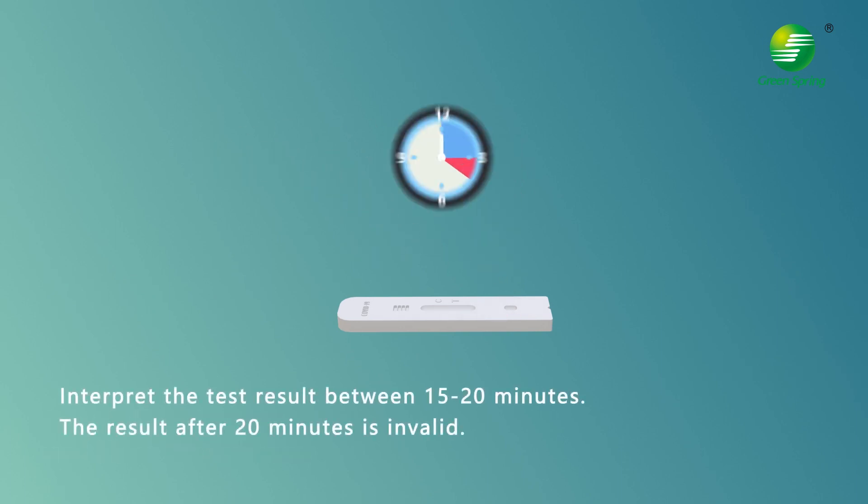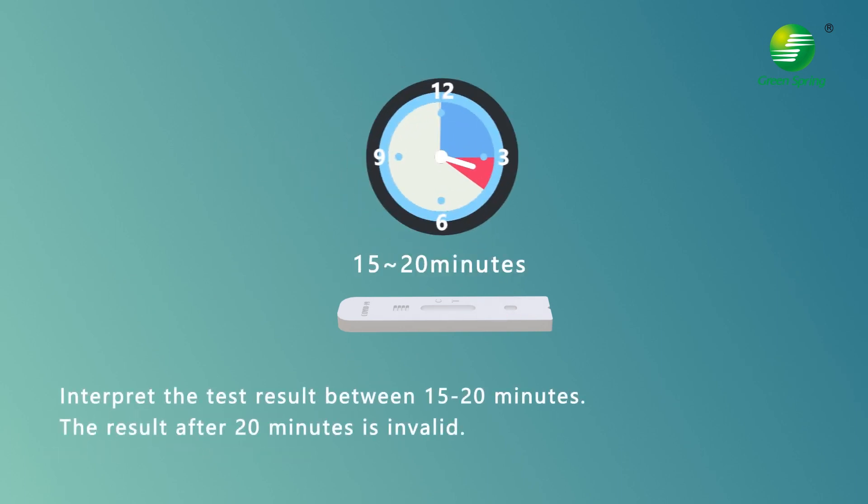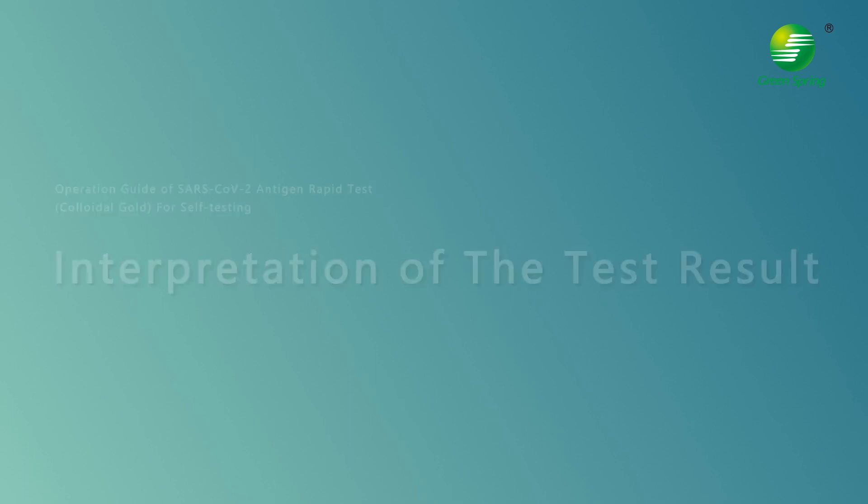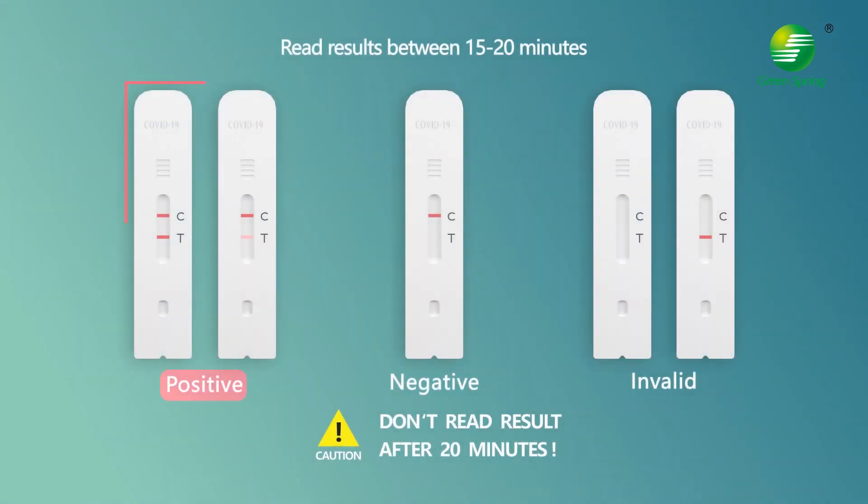Read and interpret the test result between 15 to 20 minutes — any result after 20 minutes is invalid. For a positive result, a colored line is visible in both the test line region (T) and the control line region (C). For a negative result, only a colored line is visible in the control line region (C), with no line at the test line (T).